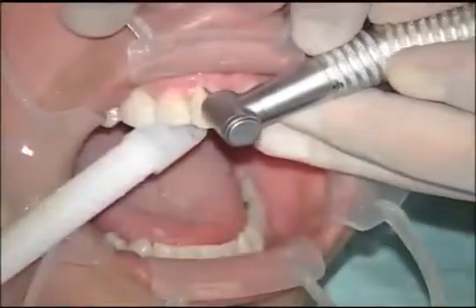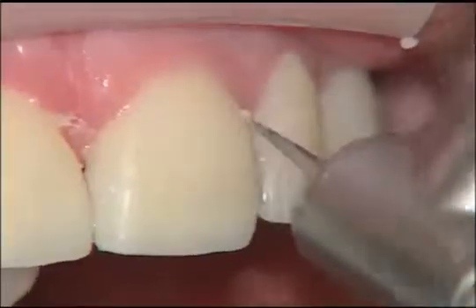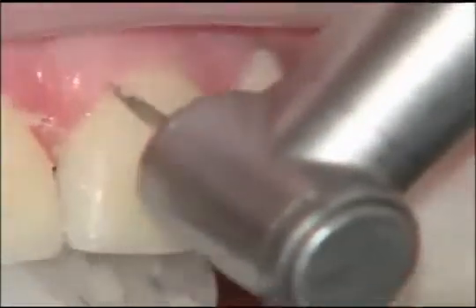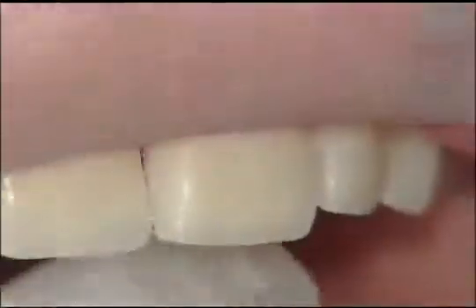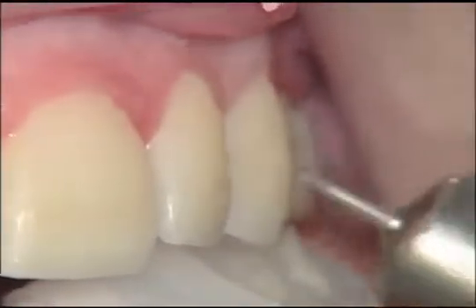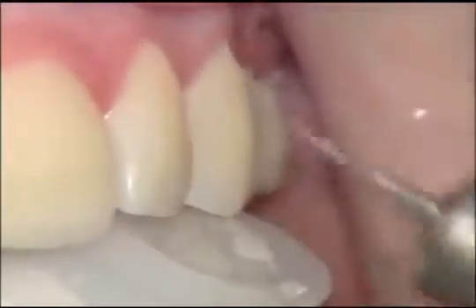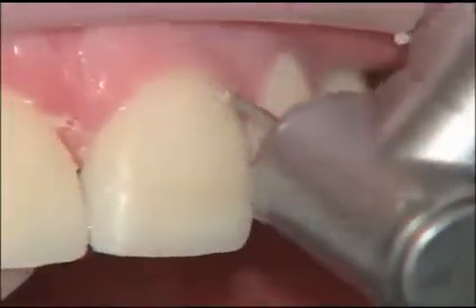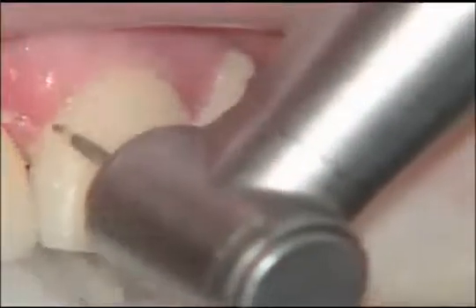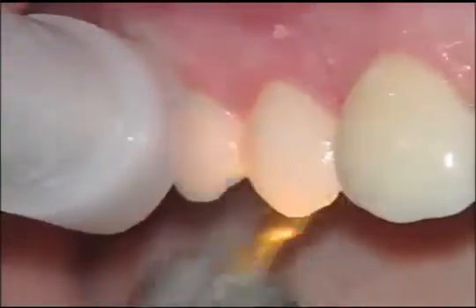Now what I'm doing here is I've got a finishing burr, a fine diamond finishing burr that I'm using to go around the margins. I'm not standing on the rheostat at all, so the burr is not spinning. What I find is these finishing burrs work very well, almost like a scalpel, except it's not sharp, to go around the gingival margin and remove any small overhangs of cement that are left. They really do a great job because they're thicker than an Explorer and they have an easier time. They don't bend like an Explorer, and so as you use them, you're able to pop that extra cement off. If you do find you have a bulky margin, as long as you're in there with the burr, you can go ahead and smooth that down at the same time.